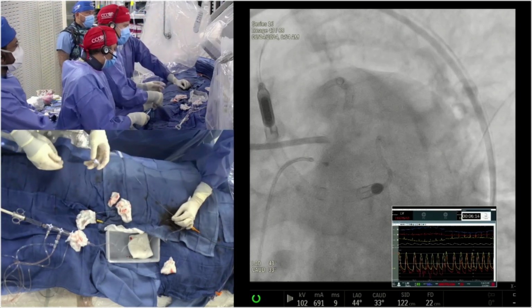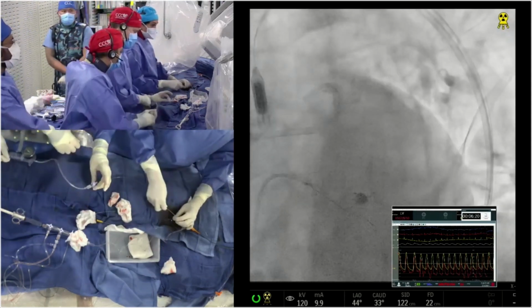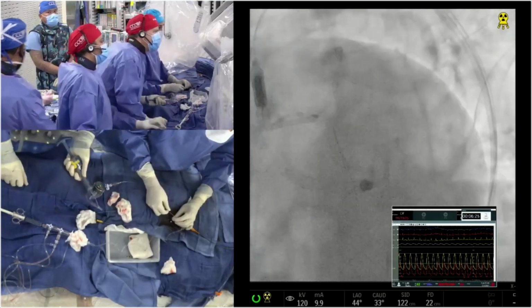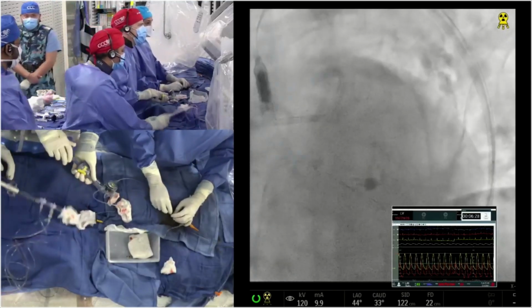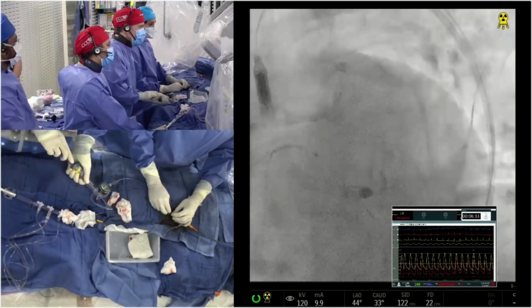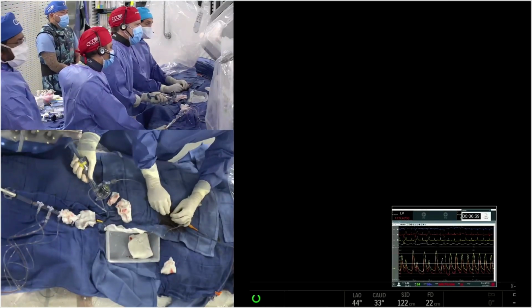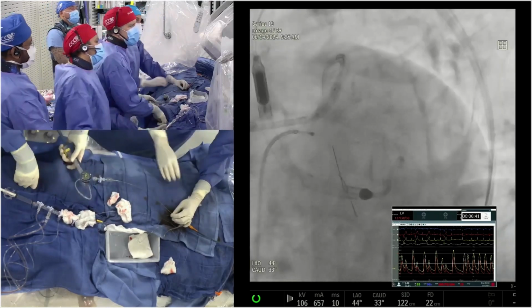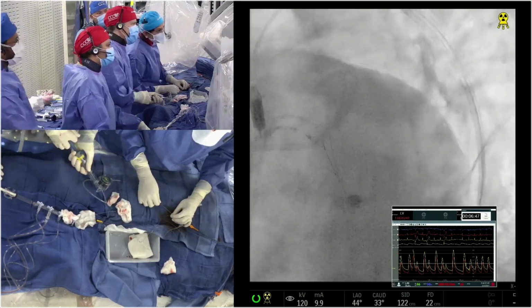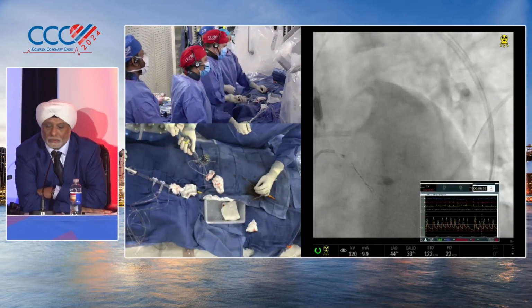Yeah, it's just my question is, once we stent the left main to LAD, no matter what, that borderline, which is a real borderline lesion, see, if it was just a plaque, it would be okay. The calcium nodule is a very difficult one to take care of later on, subsequently. Go up, yeah. This is a 40-15 NC. I mean, according to the definition criteria, this is a high-risk bifurcation. The problem is the lumen is big and it's a nodule. And with a lot of these stents you put in, the nodule usually comes through the stents also. So it's not really easy. If the lumen is big enough, I would probably do provisional here.